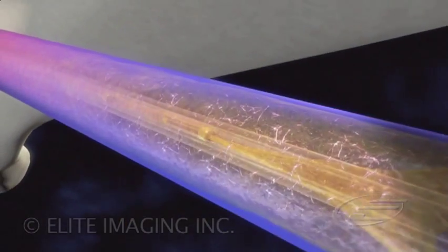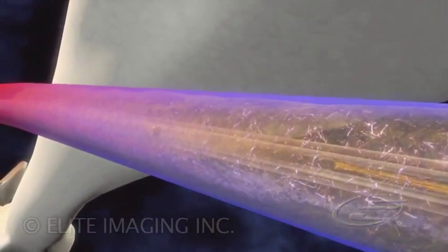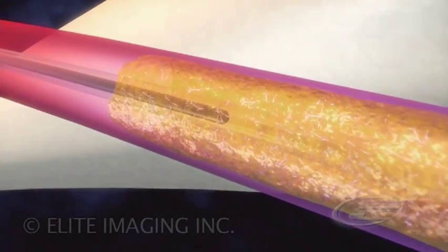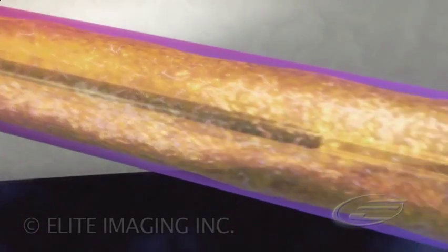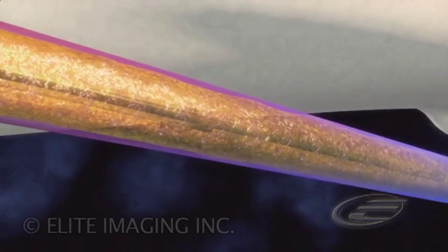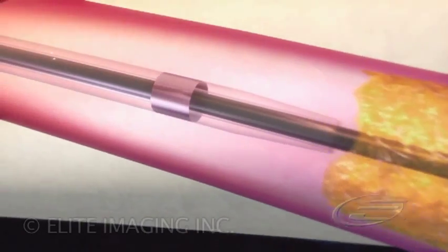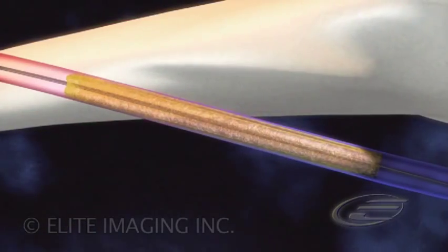When thrombolytic therapy is complete, the ultrasound core is removed and the guide wire placed back through the drug delivery catheter. The catheter is removed, leaving the guide wire in place, providing access for definitive treatment of the underlying disease.